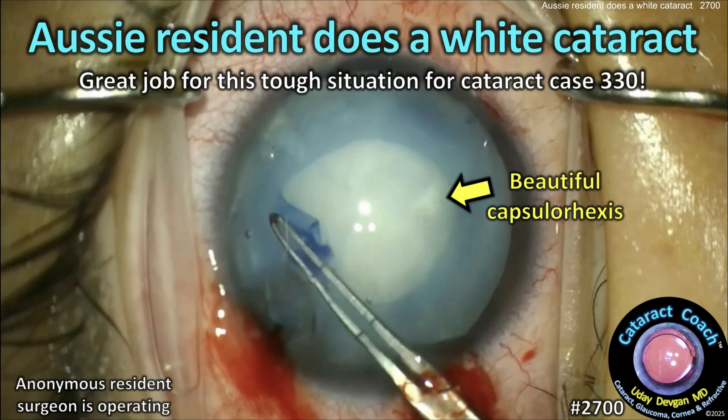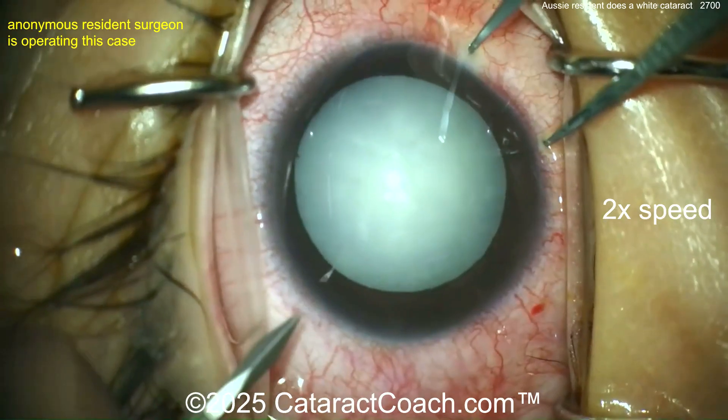cataractcoach.com. An Aussie resident does a white cataract — really great job for this tough situation — for cataract case number 330. Let's watch together here.